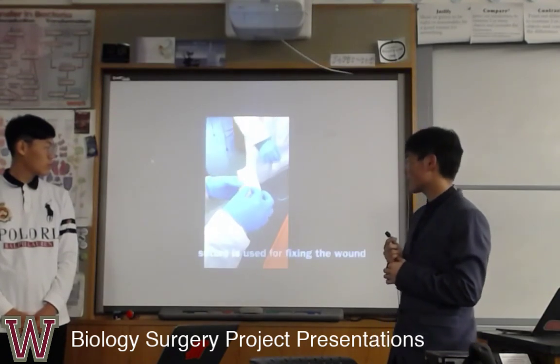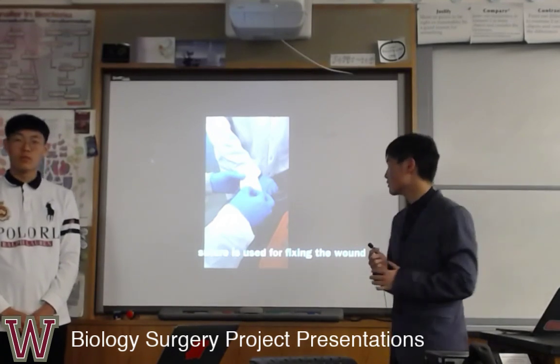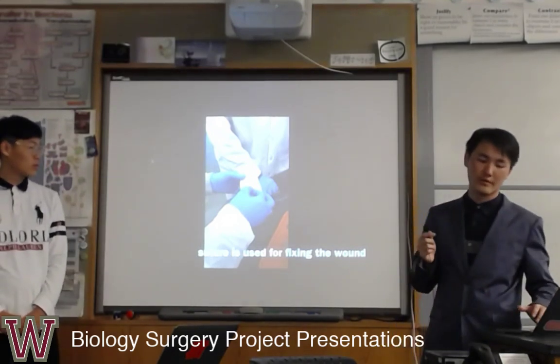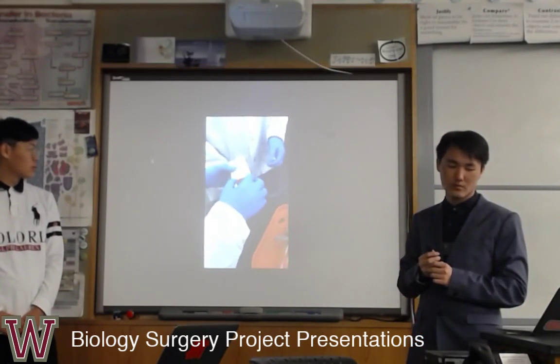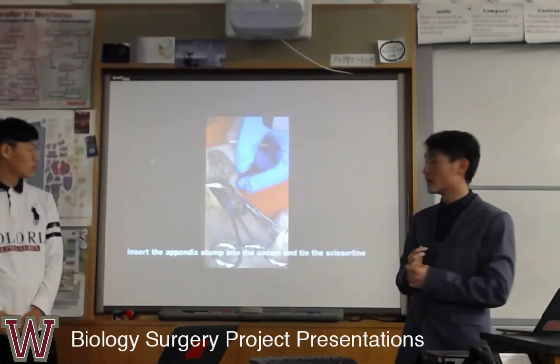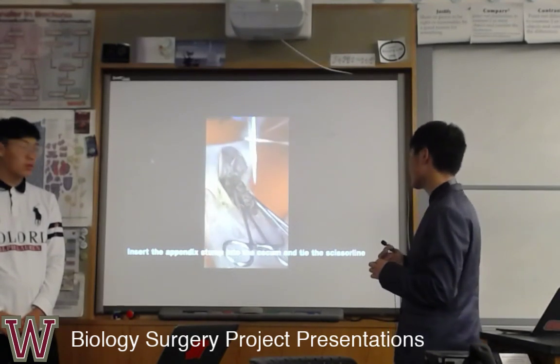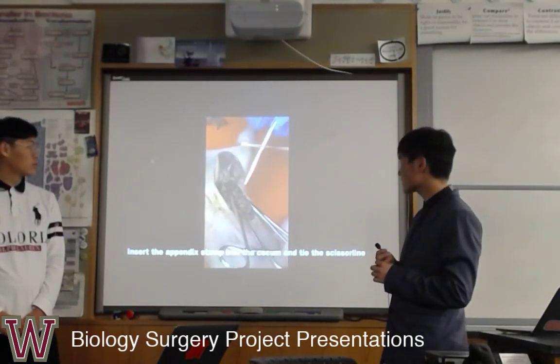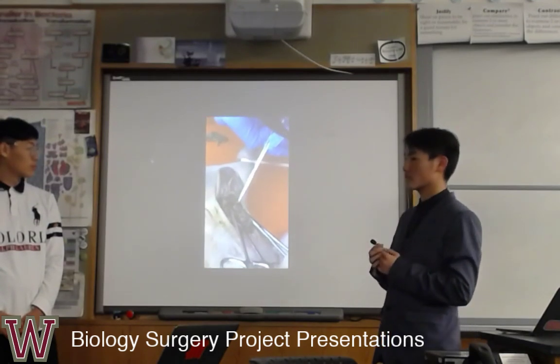Next step, we use the suture to fix the wound. We insert the appendix stump into the cecum, tie it, and use the tiny suture to fix it.